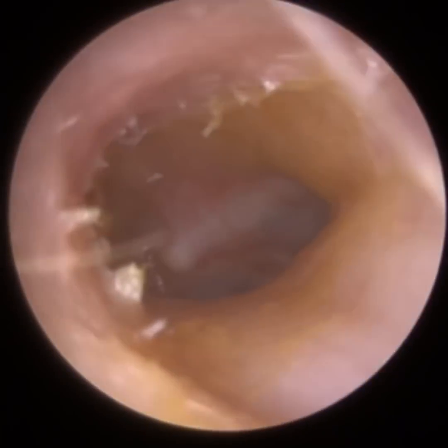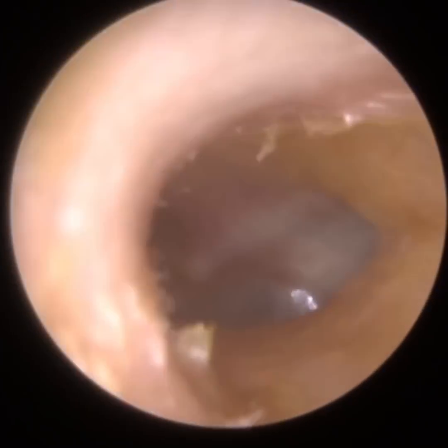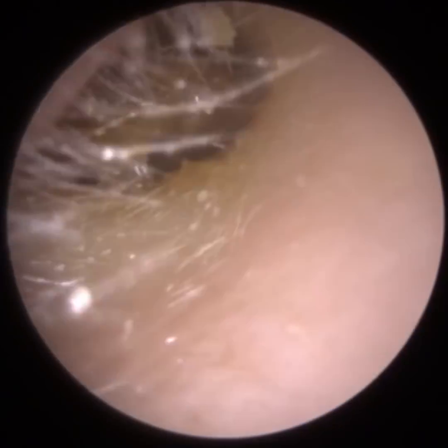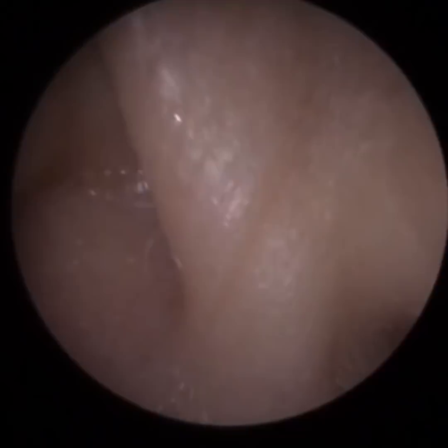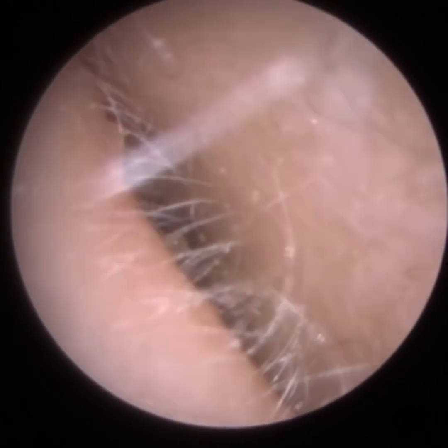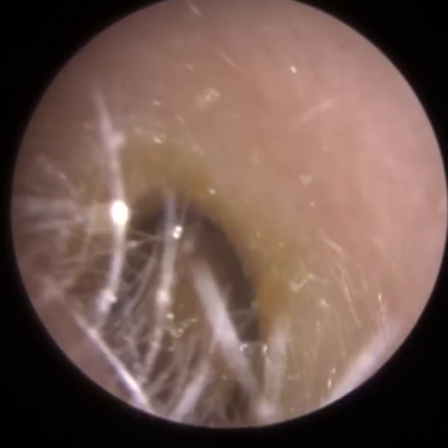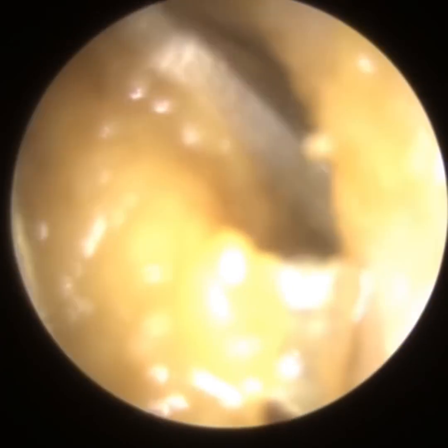So when we say retracted, we mean the eardrums are buckled inwards. You can see the attic, the top, the pars flaccida, what we call, it's just sucked inwards. So there's negative pressure behind the eardrum because the ear can't equalise itself. The eustachian tube, which is an orifice that connects the middle ear, the cavity behind the eardrum, to the back of the nose, is blocked at the back of the nose, causing the eardrum to get sucked in.